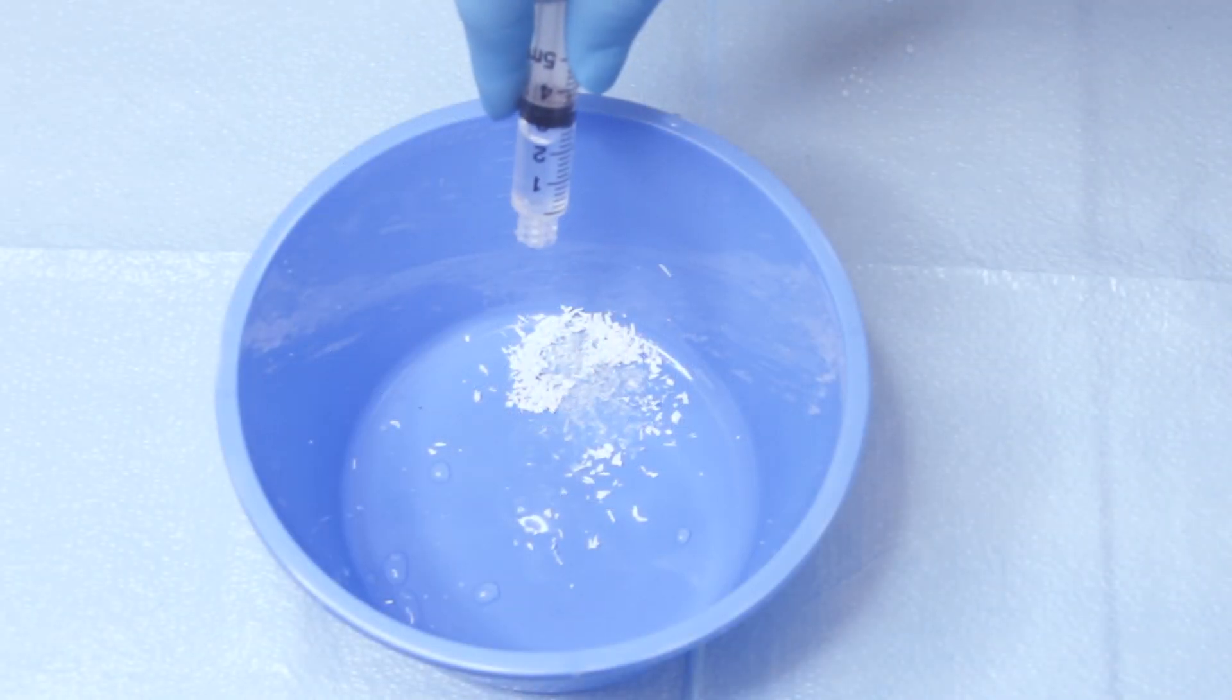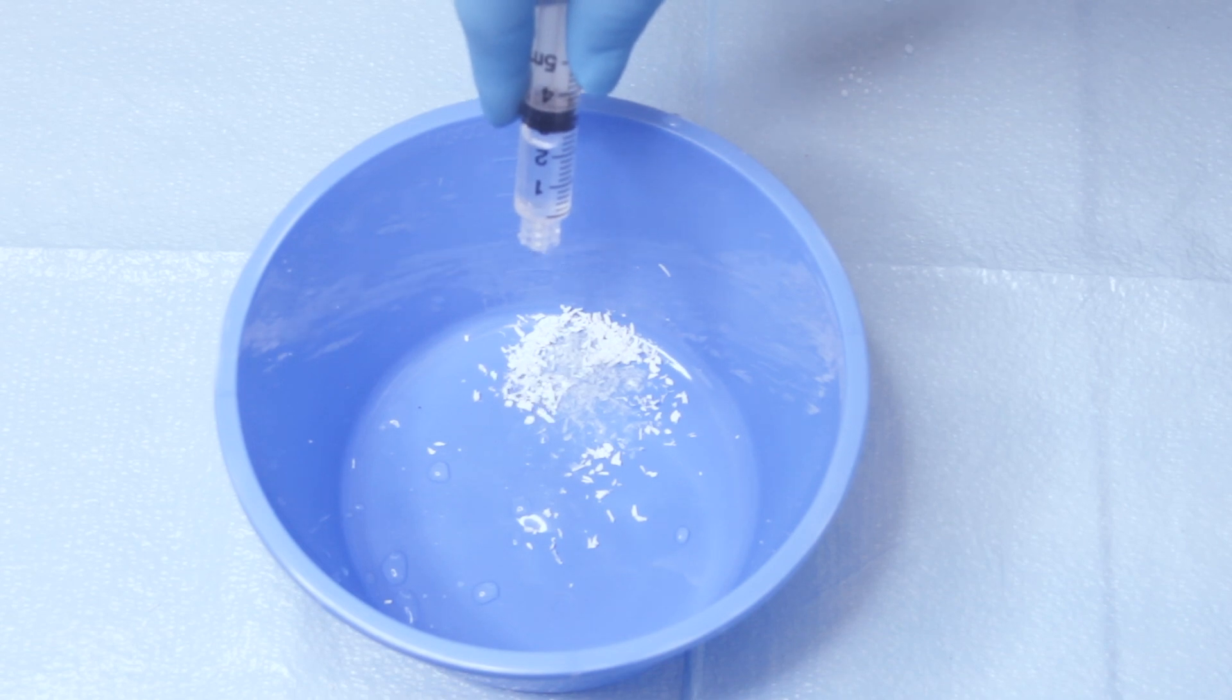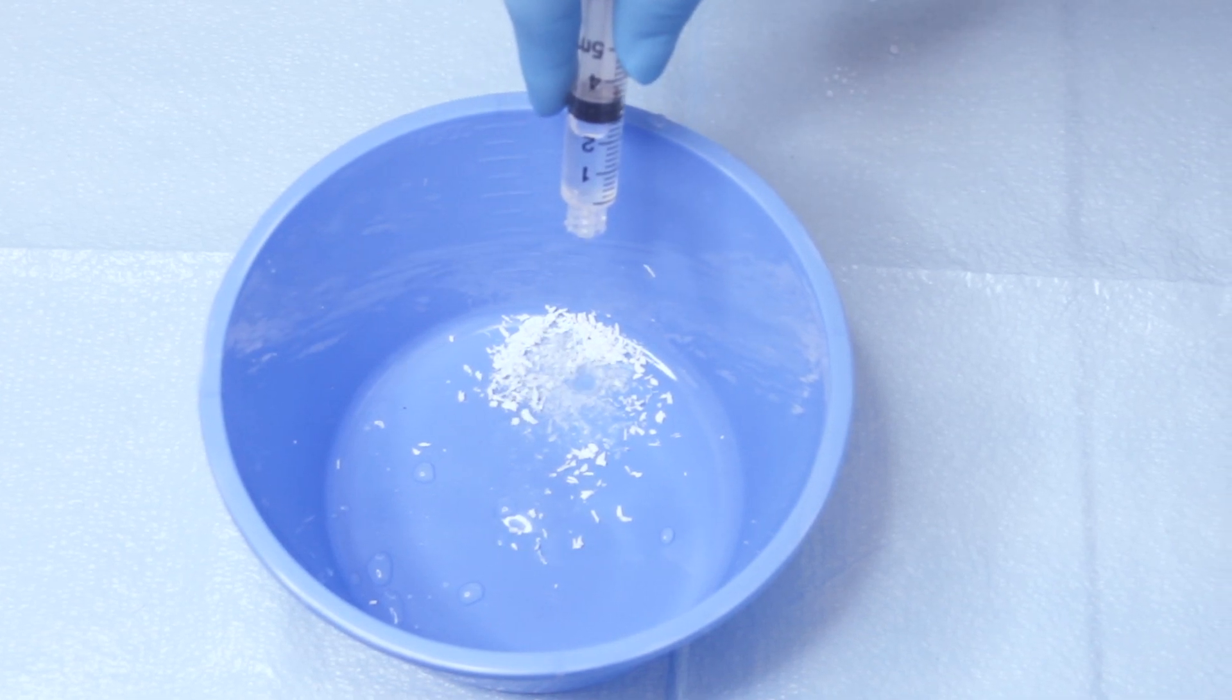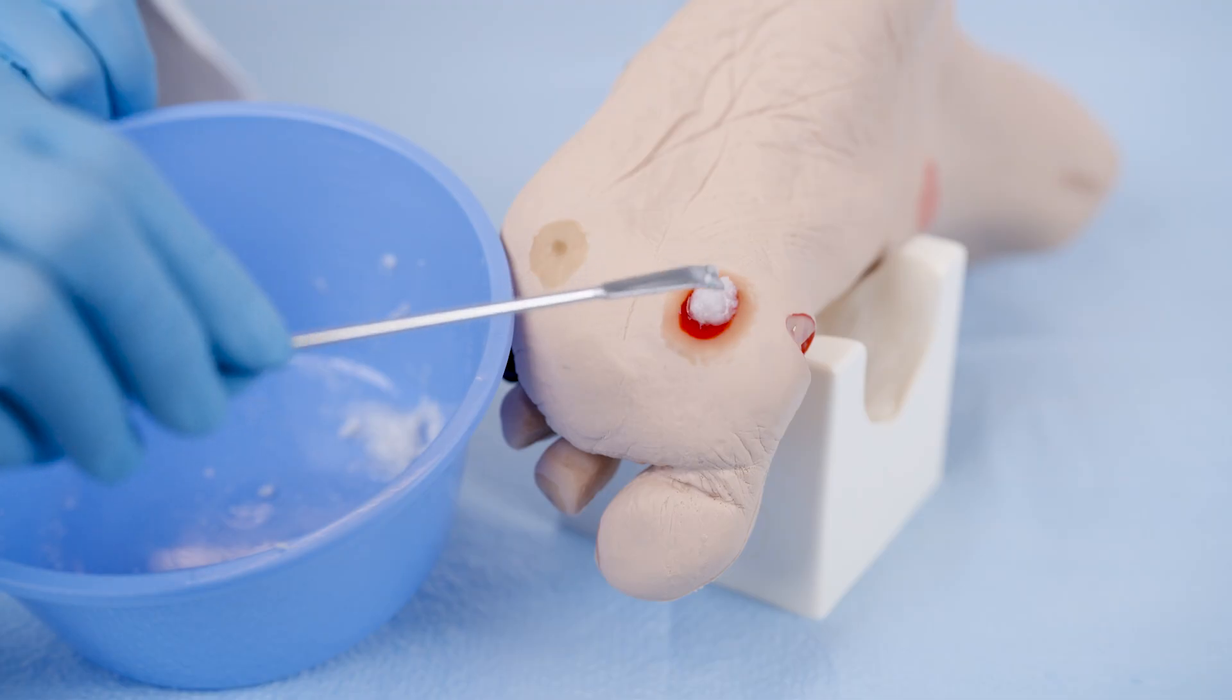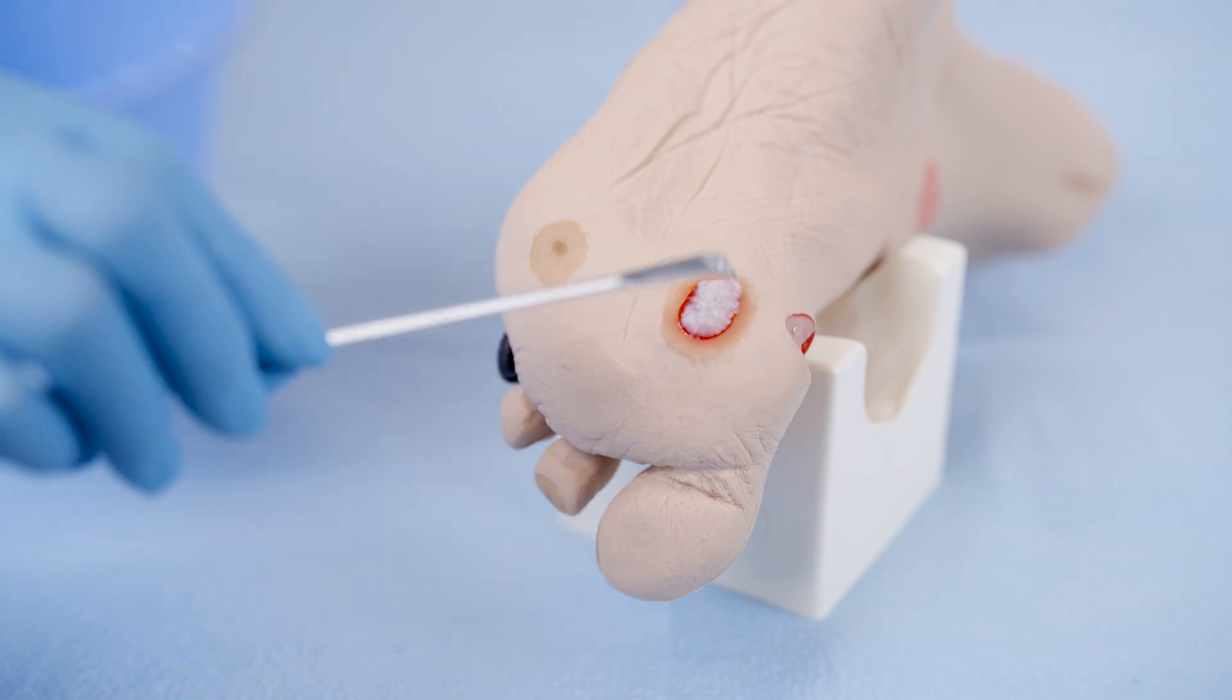For a paste consistency, slowly add sterile saline to the particles until the desired consistency is obtained. Apply the device immediately following preparation for use.